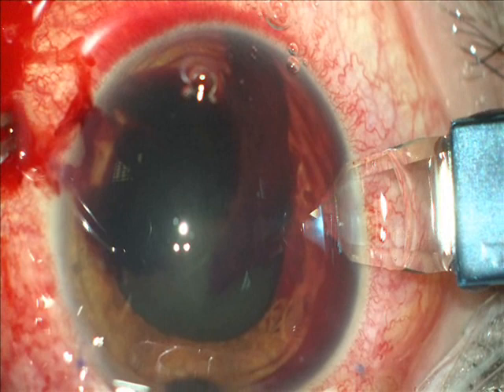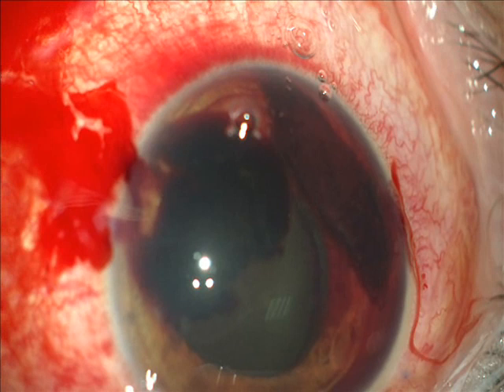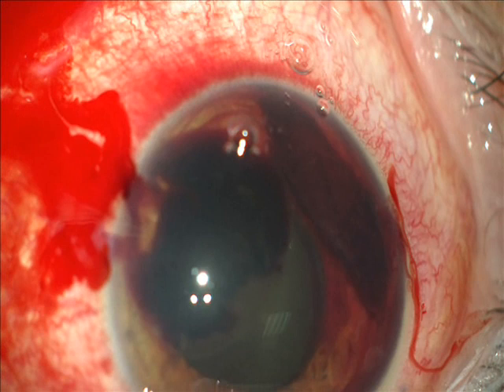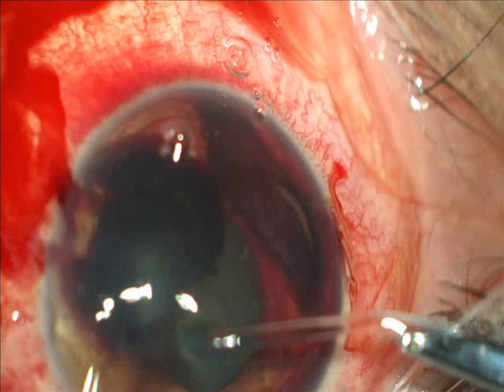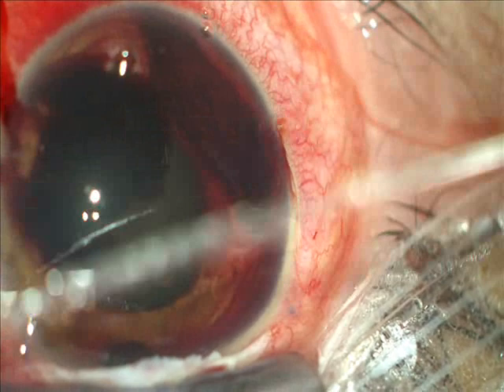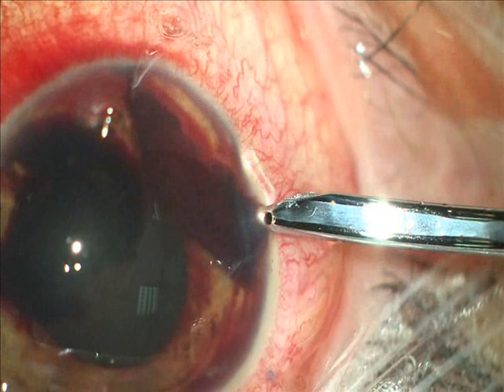This eye belongs to a young lady. It is a very advanced glaucoma. The lady is phakic and this glaucoma is due to chronic cortisone drops and ointments. She was operated on with a trabeculectomy which failed after two months, and I converted this failed trabeculectomy to a canaloplasty.